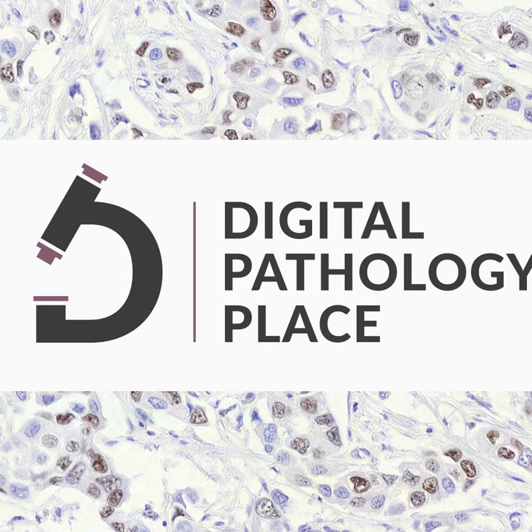Yeah, those are really good questions. So remember, the precision study did not compare to microscopy. That would have required us having a microscope set up and an arrow saying what's this feature on the microscope, and then doing the same thing digitally. So that was not done. So we can't really say anything about comparison to microscopy with the precision study design.